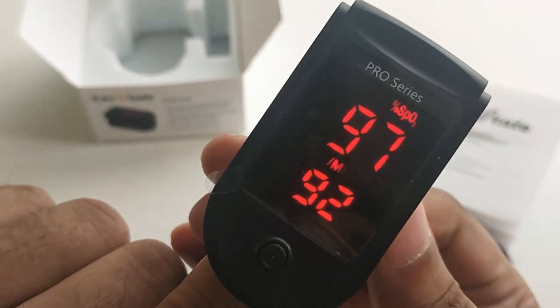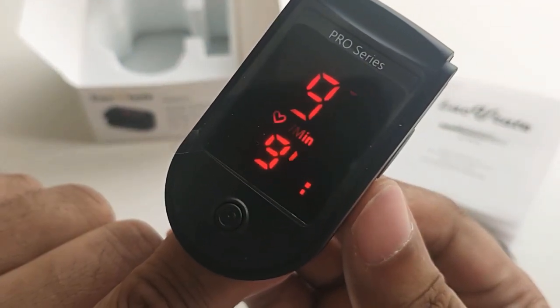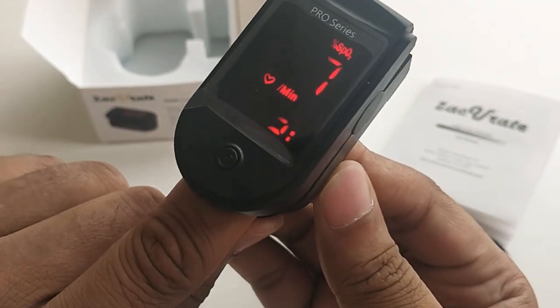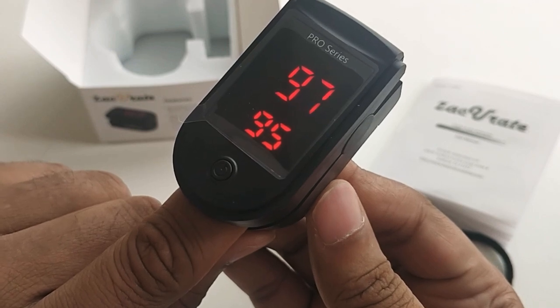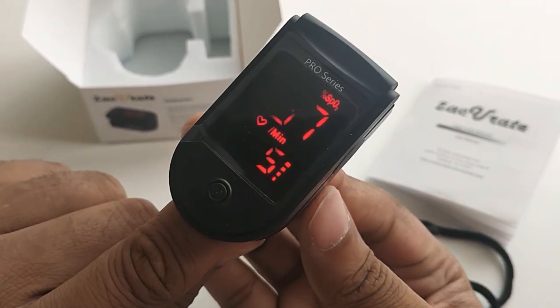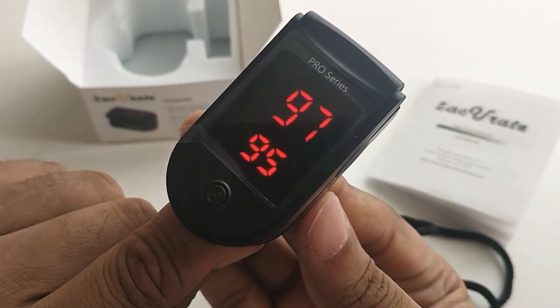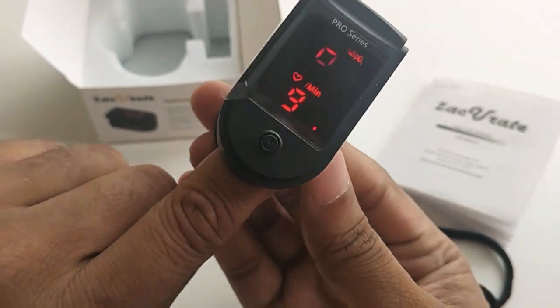The lower reading is the pulse rate — you can see it is 94 here. Your pulse rate should be between 60 to 100 depending on what you are doing. The current reading is 97, so the oxygen level in my body is standard.